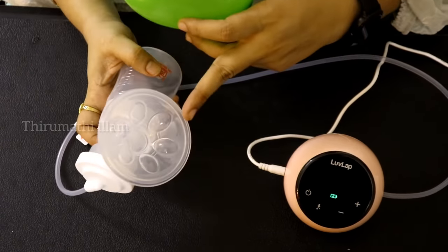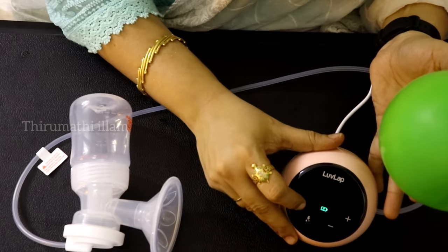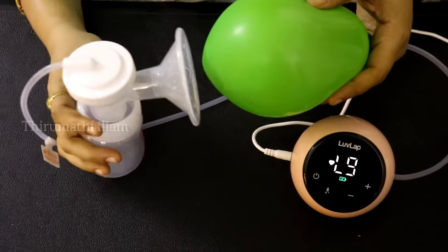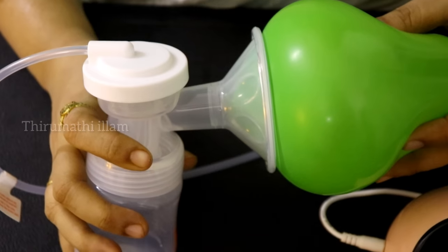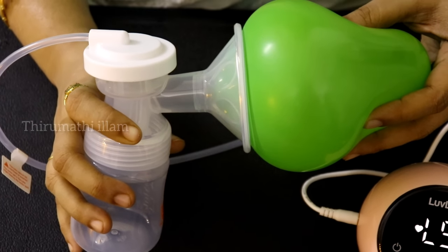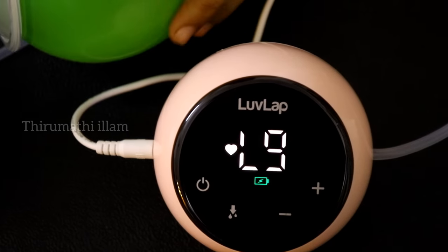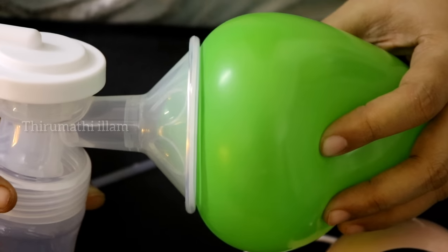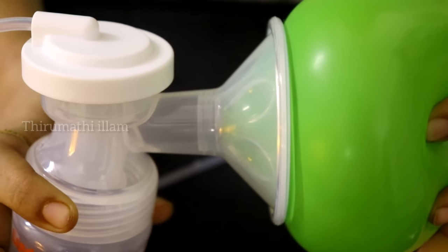First, we have the massage cap. We have the nipple placed in position. We press it and switch it on. Now we have the stimulate mode active. The nipple is positioned correctly. Now we will extract into the bottle. We collect the milk in the bottle and extract from the side of the bottle. After that, we remove the bottle. Let's see how the suction power works through the session.